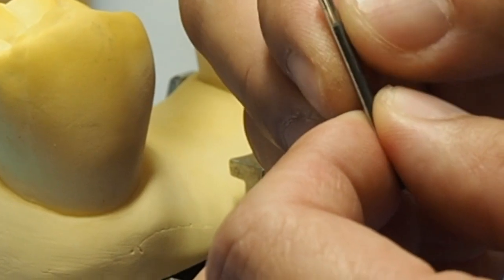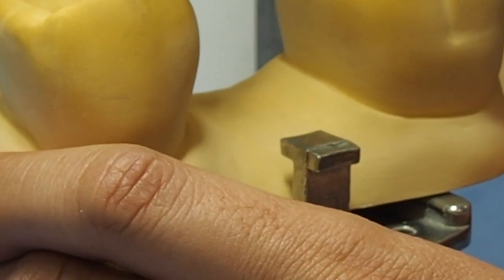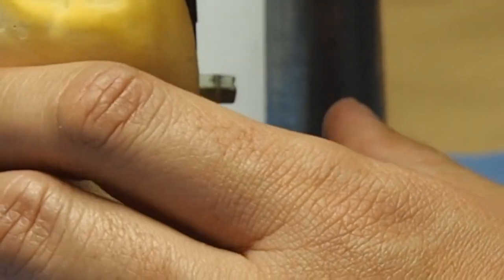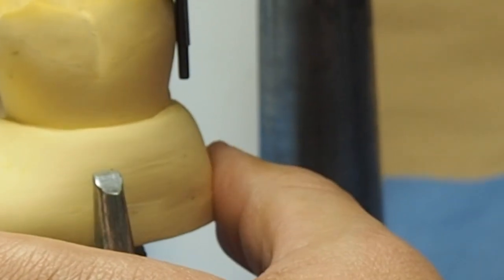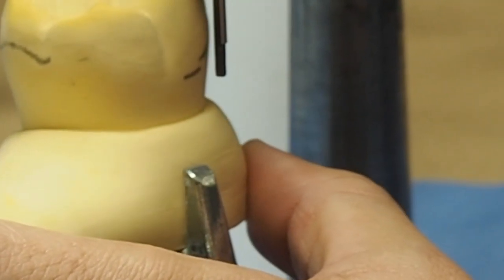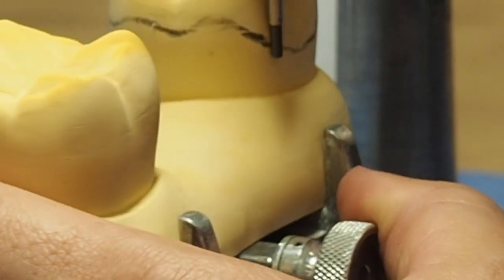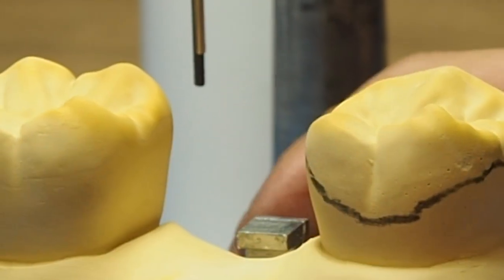But then you can also look on the buccal and the lingual approximately where you think you're going to need undercuts for retentive clasp. Now he's getting ready to put the carbon marker on with the sleeve. Bring it down and encircle the tooth by moving the tooth. You can see you want the marker touching somewhere in the middle, but not the tip or up by the mandrel. But actually doing it on these gorilla teeth is a little tricky almost, but they're almost too big. What's the idea for you to see these features?